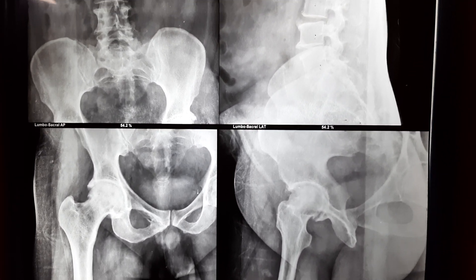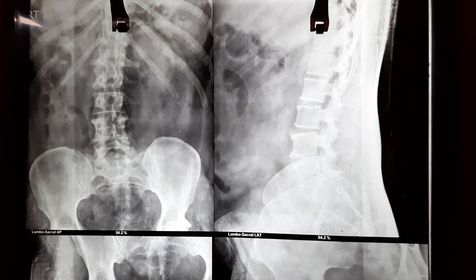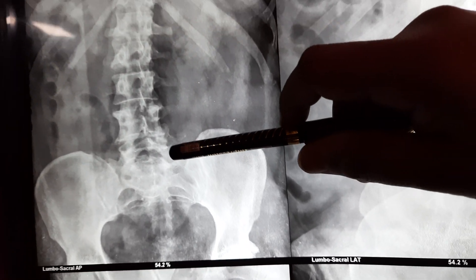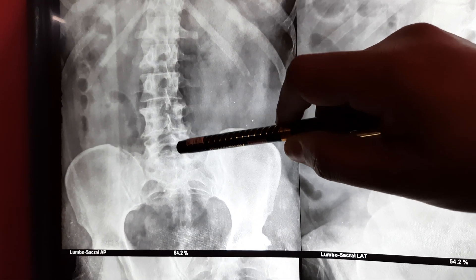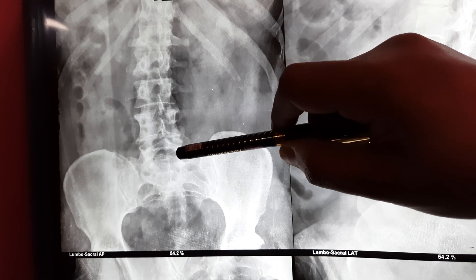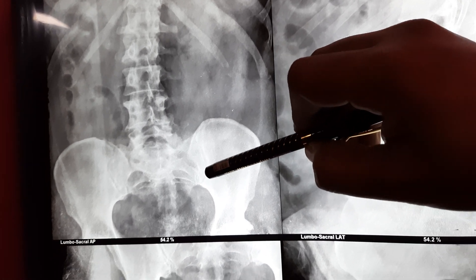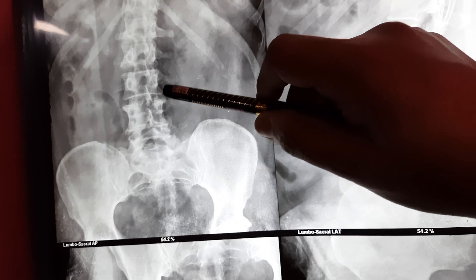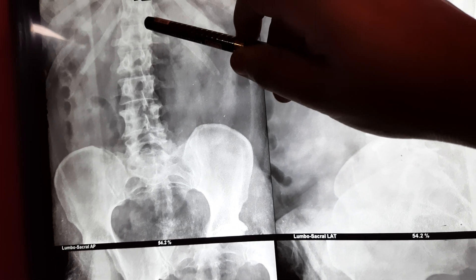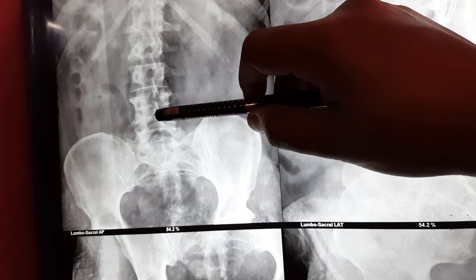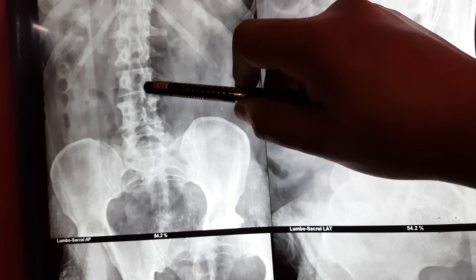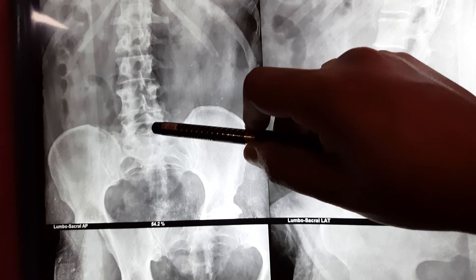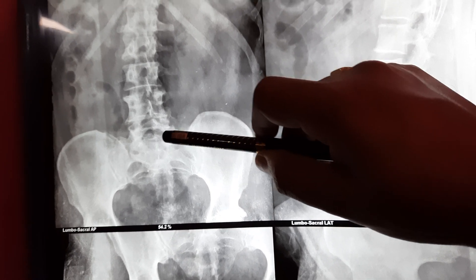First we will look at the lumbar region findings. In this view we can see L4 and L5 vertebra, the SI joint lines on both sides, and the intervertebral spaces. Looking from L1 to L4, it is normal. We can see the spinous process of each vertebra in a normal straight line, but by the time we reach the L5 spinous process, it is slightly tilted.